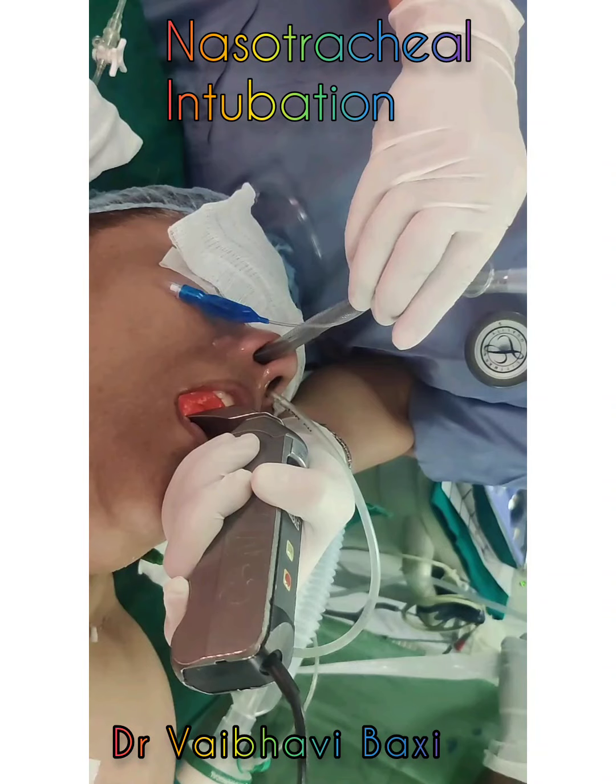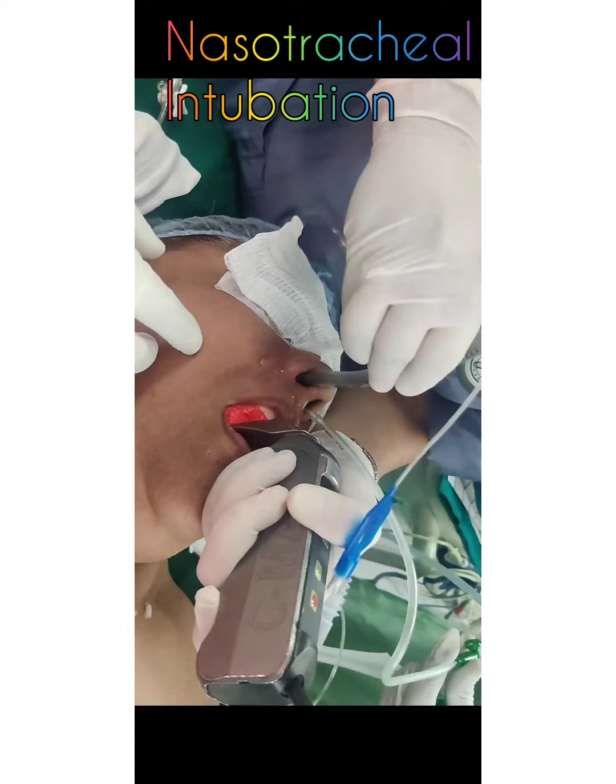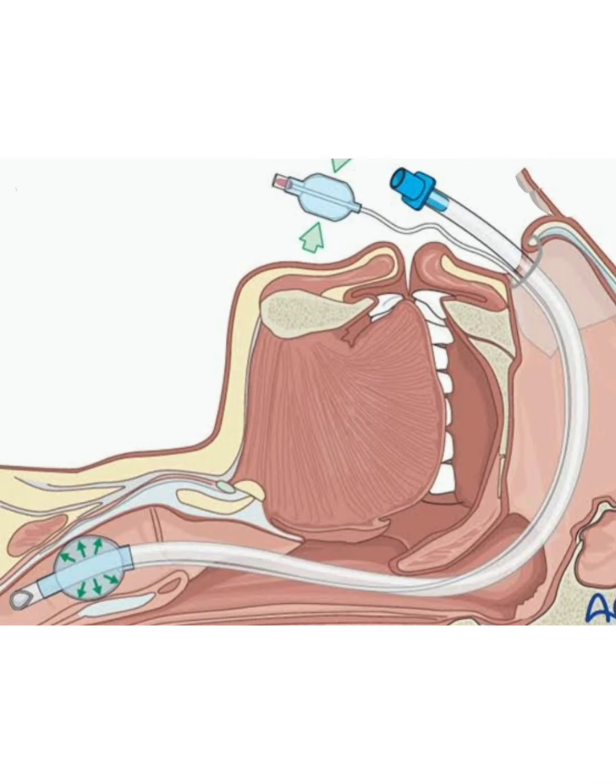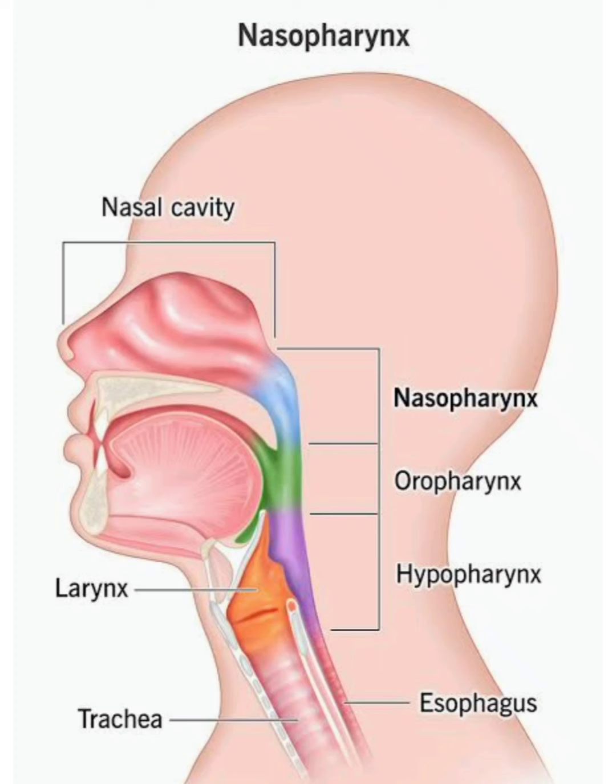Nasotracheal intubation involves passing the endotracheal tube through the nares into the nasopharynx and then through the larynx into the trachea. It is an essential skill for anesthetists and emergency medicine doctors. Performing nasotracheal intubation requires knowledge of the anatomy of the nasal vestibules, nasopharynx, oropharynx, and larynx.